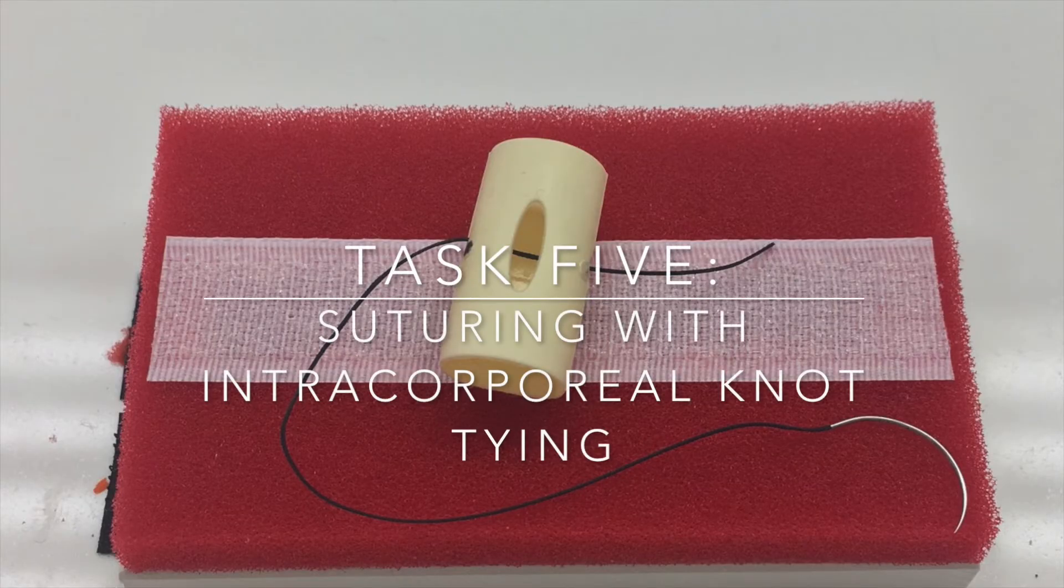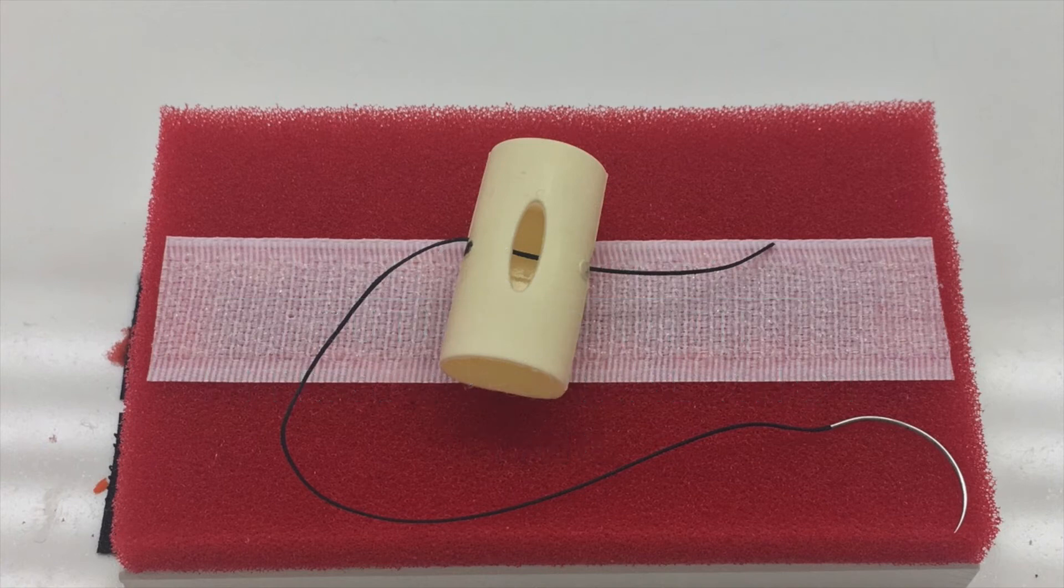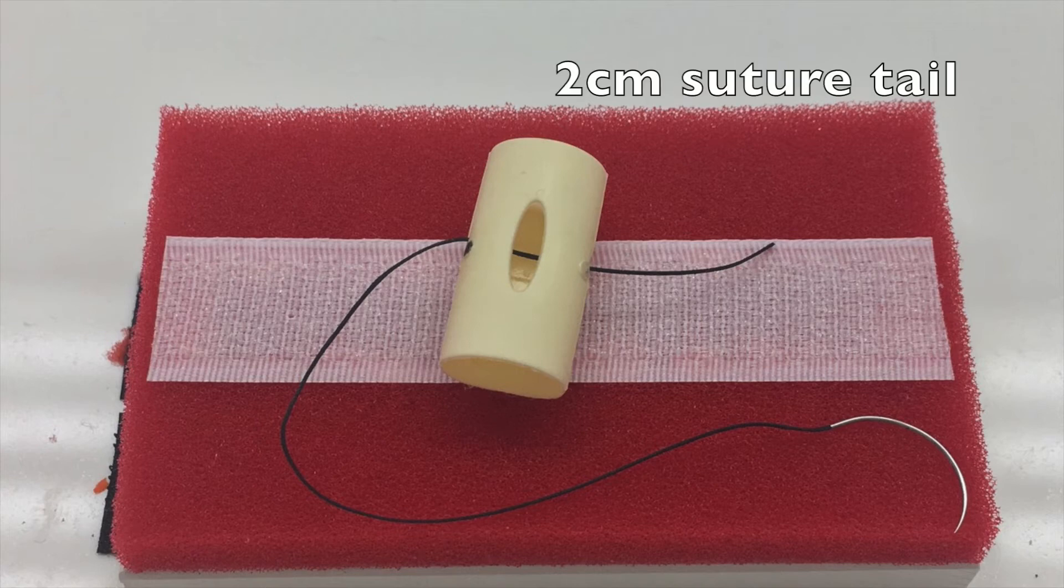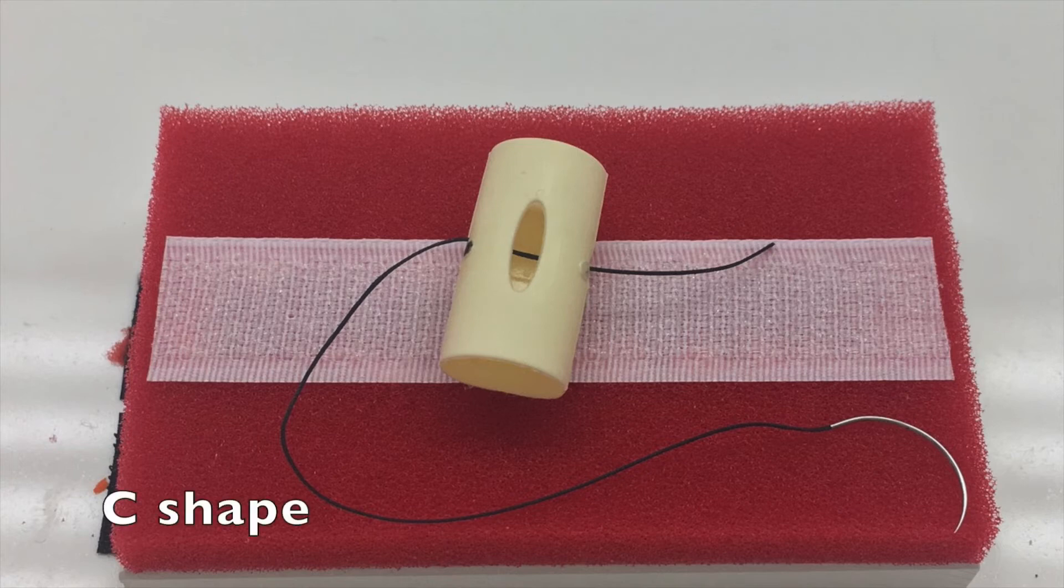Task 5, Suturing with Intracorporeal Knot Tying. After placing the needle through the incision, pull the suture tail to approximately 2cm in length and orient the suture in a C shape.